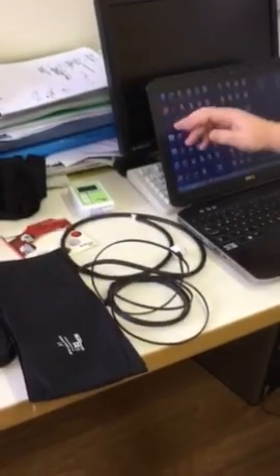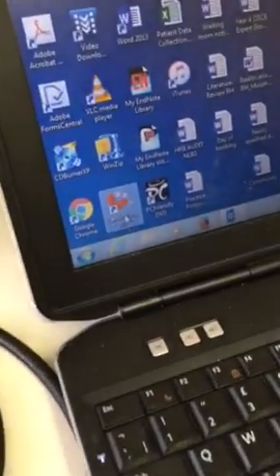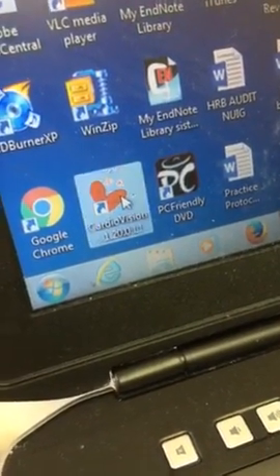Hello and welcome again. We're just trying to show you how to use the ABPM that we've provided for the practice with the Meditech 05. First things first, we will have loaded the software onto whatever PC you have in the practice that would usually have it. This is the MediVisions logo. It's a heart like this, CardioVisions, pardon.